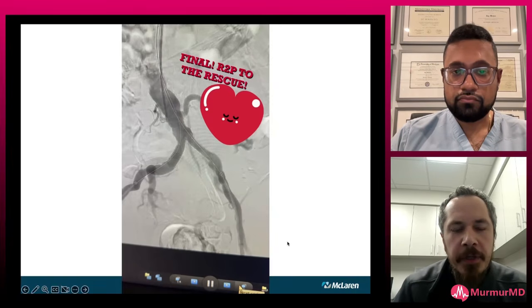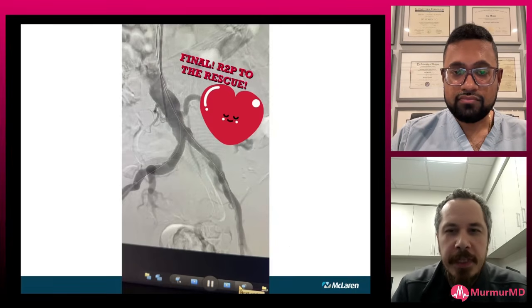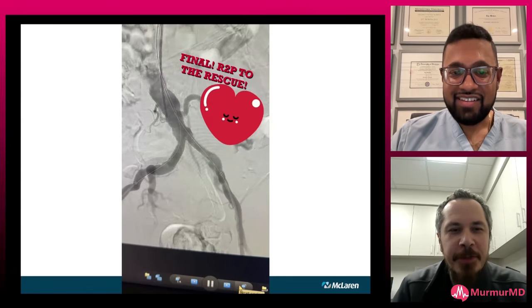Excellent. This is a beautiful case. So I don't know how we're gonna beat this one, because this is a really, really nice case. So excited to see the next one.